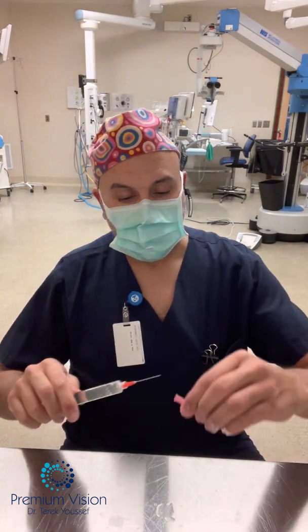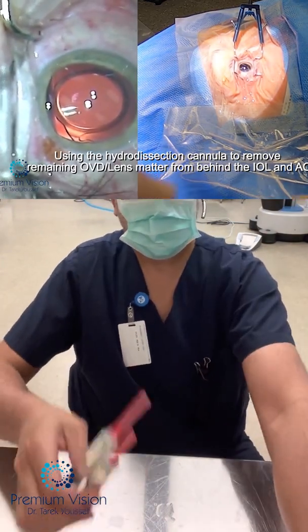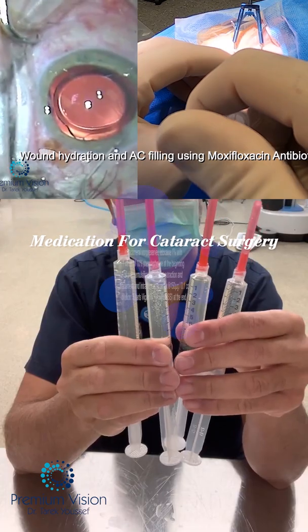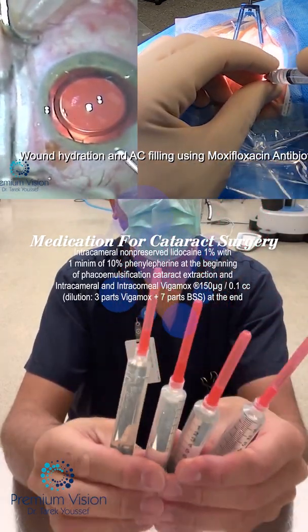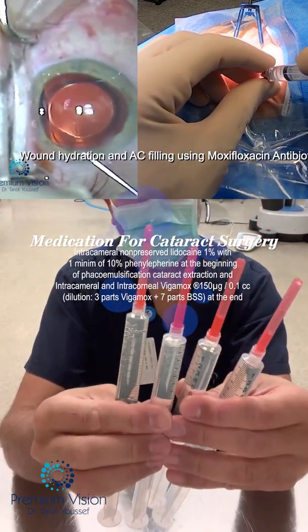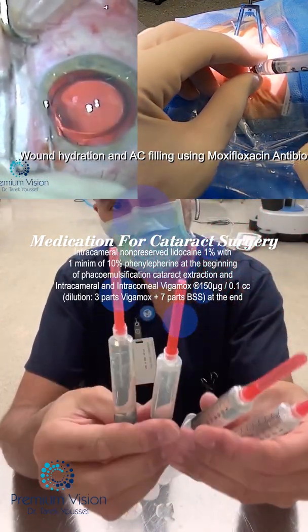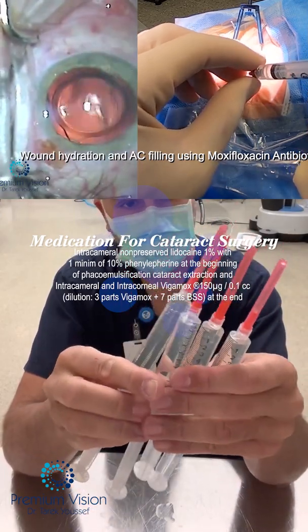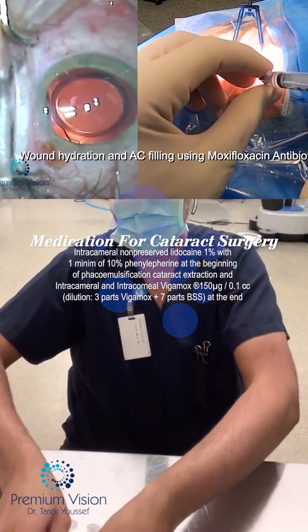So now we have four of these syringes. Per patient I use 1ml, so this is good for 40 cases. I'm going to do 30, but spare just in case.